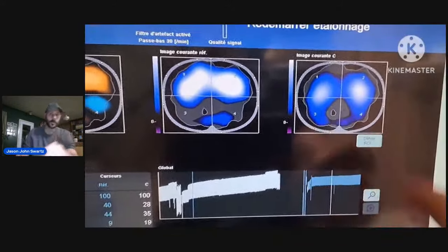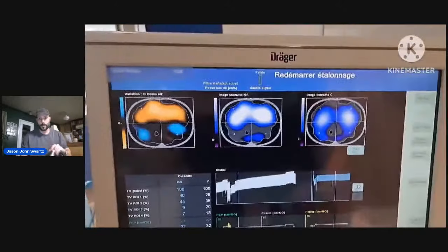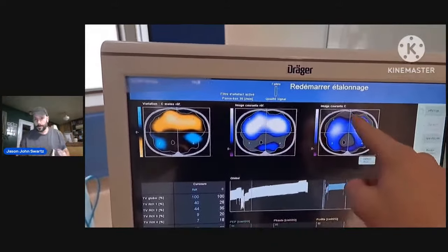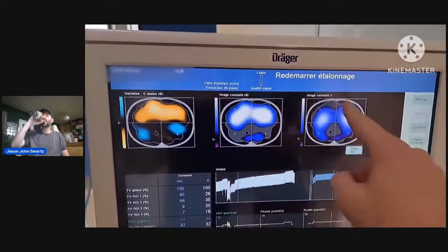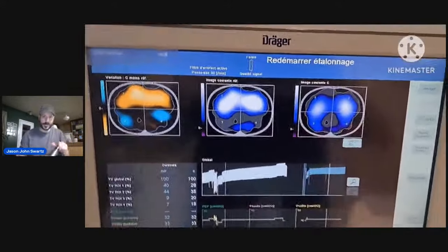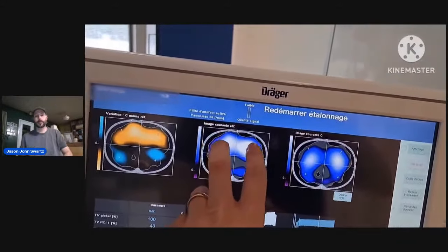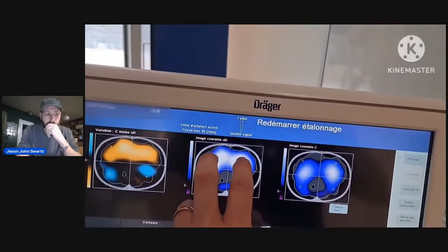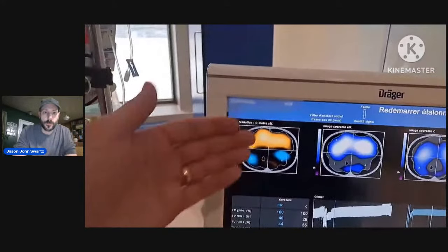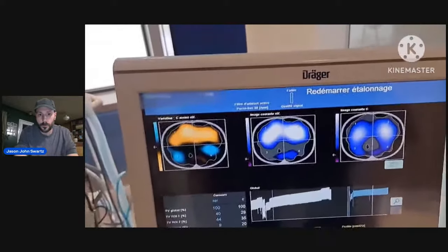Improvement here in this region. And again, a color-coded way of expressing this is the reference here, prior to proning, and then proning. Supine, proning. What happened here is when we opened up the dorsal regions, volume was able to be distributed from there. So that took a lot of volume from the ventral areas. So that's a good thing. This is the color-coded expression of the dynamic shift in ventilation comparing your reference to your control.